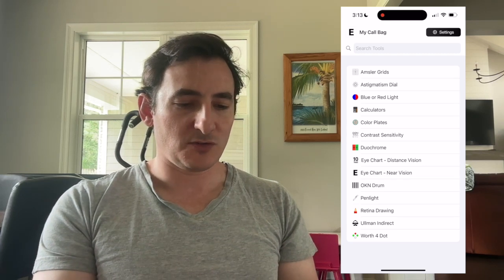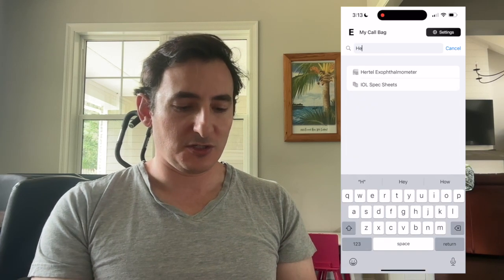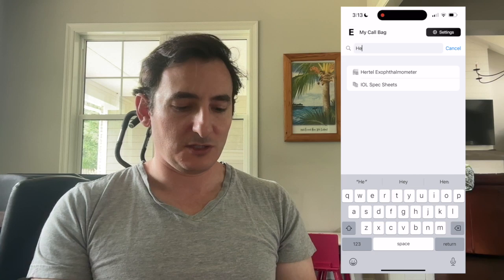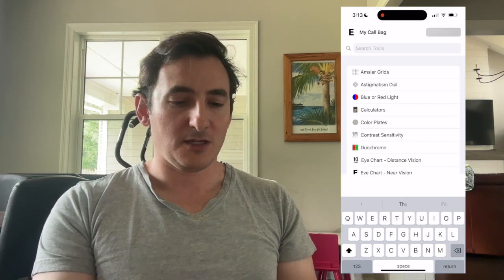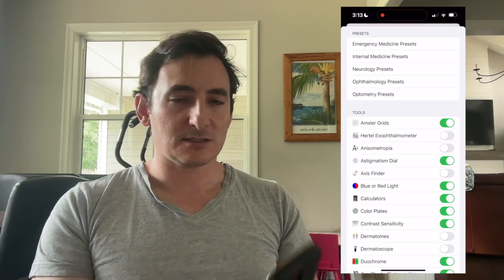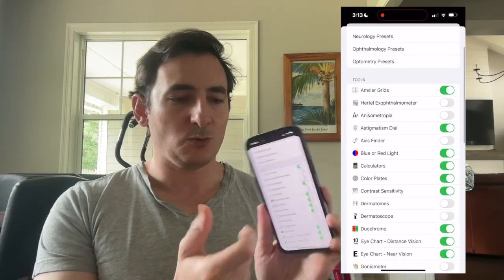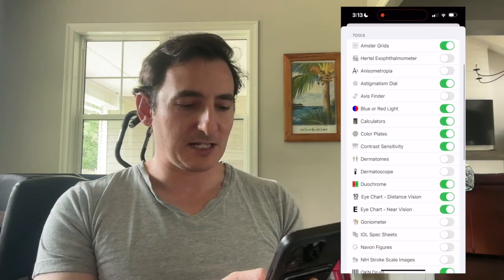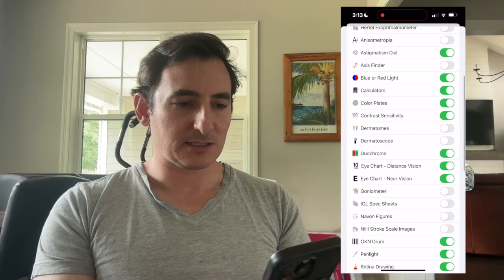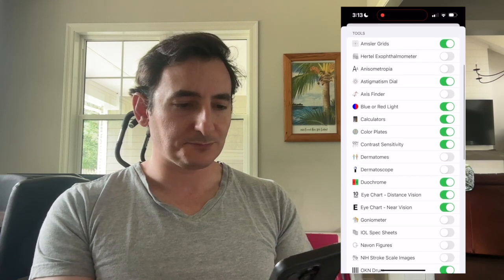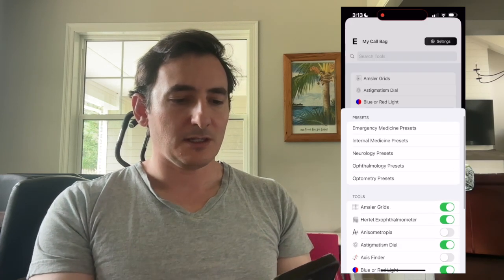You can search in the search bar for Hertel Exophthalmometer, or if you go to settings and you see your list of tools, you can activate the Hertel Exophthalmometer there.